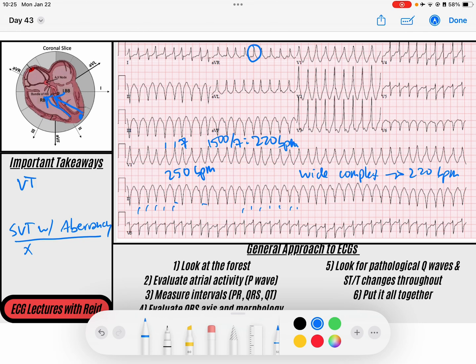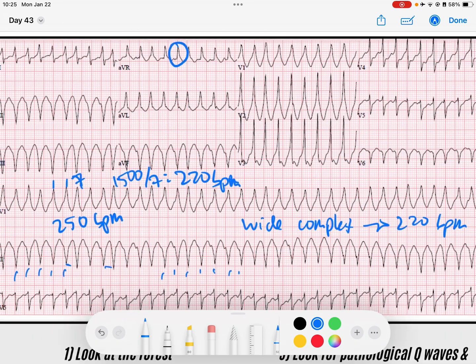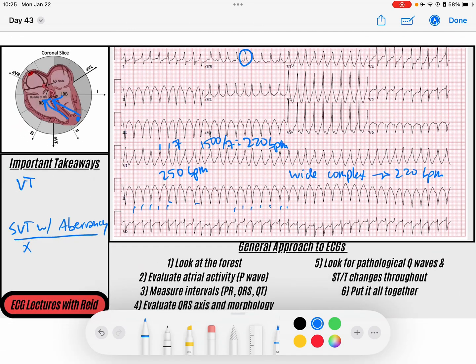Something else that we can do to help determine is this SVT with aberrancy is I look at the QRS morphology. I know that aberrant conduction through the AV node would be like a right bundle branch block or a left bundle branch block. So I look at my lateral leads and maybe V6, V5, 1, and AVL and I don't see things that look like left bundle branch block criteria. And I look through V1 and V2 and I don't see anything that looks like right bundle branch block. I don't see any QRS morphology that closely resembles a right bundle or a left bundle branch. So that's points away from SVT with aberrancy.